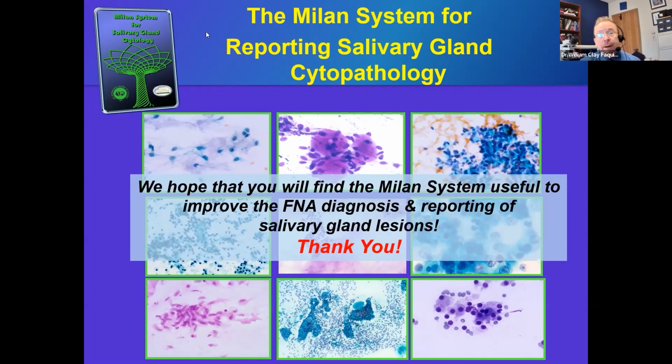Yeah, well, it certainly is possible to scrape material off of glass slides and do molecular testing from that. We have experimented with that in our department, and we have gotten it to work. I know other places have gotten it to work. There are publications in the literature about doing that. But the thing is that you're going to have to make sure that your molecular lab, wherever you're sending your material for molecular analysis, is used to dealing with material scraped off of a glass slide. But yes, it is an option.